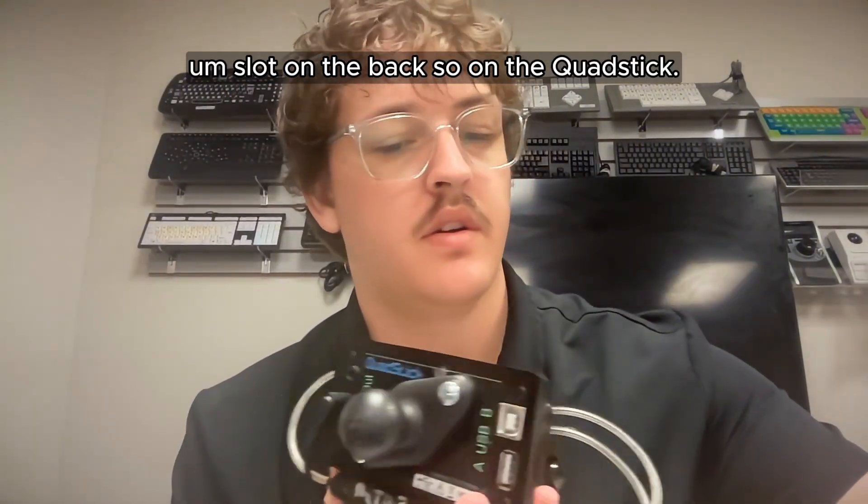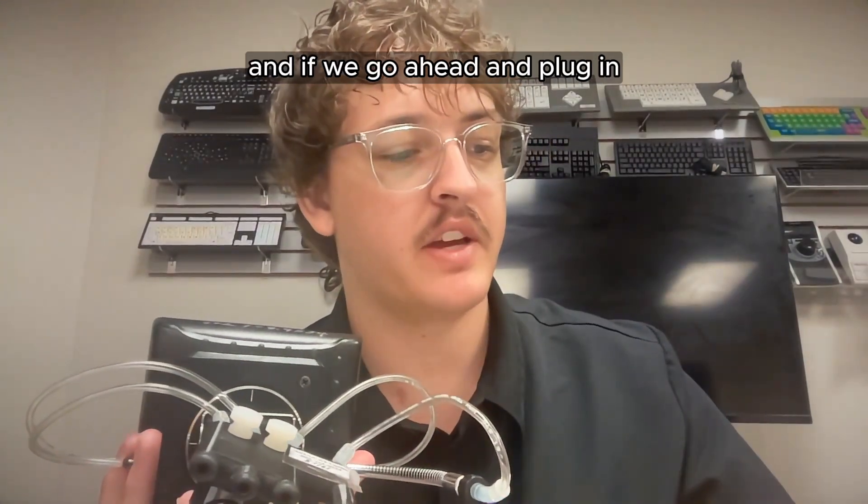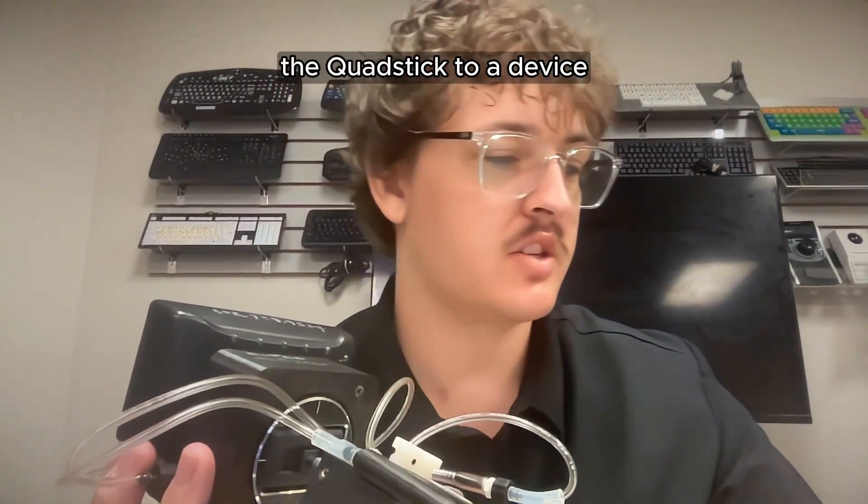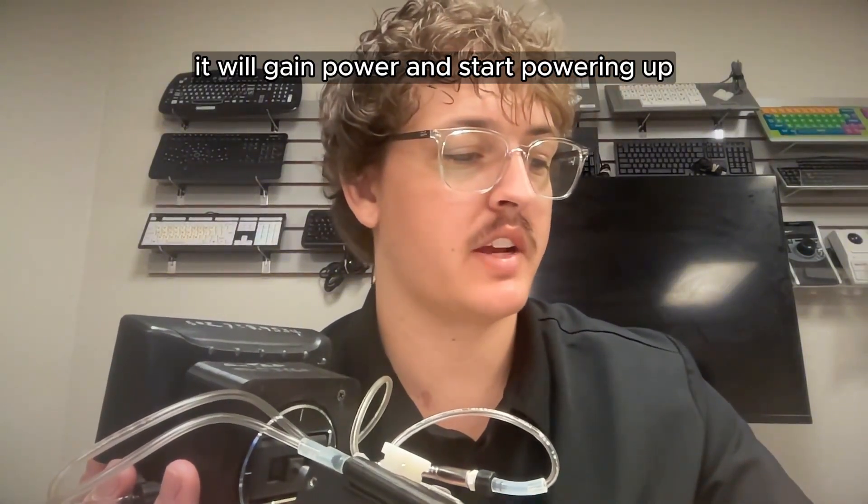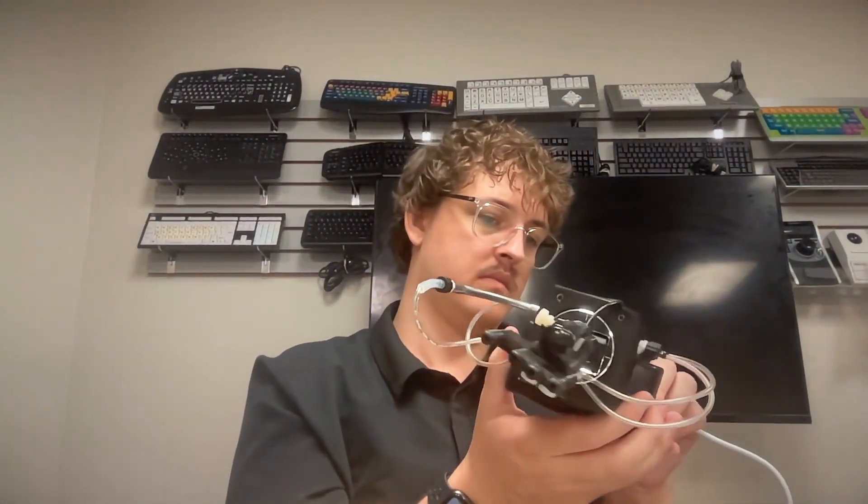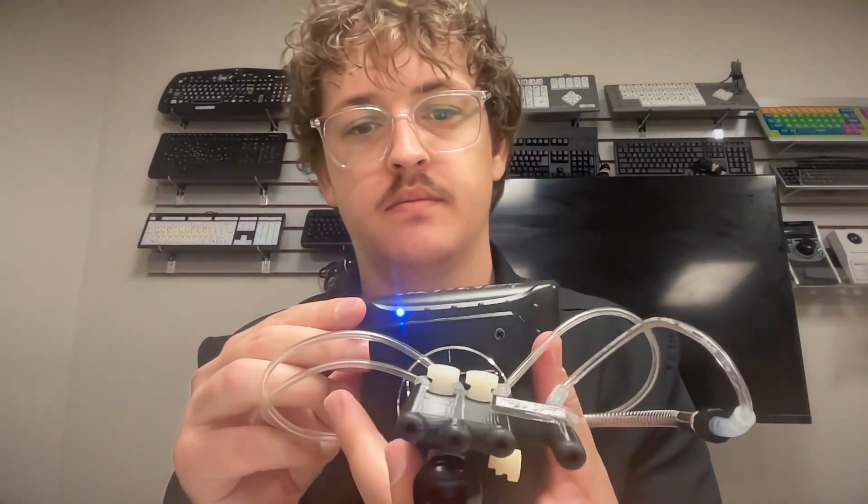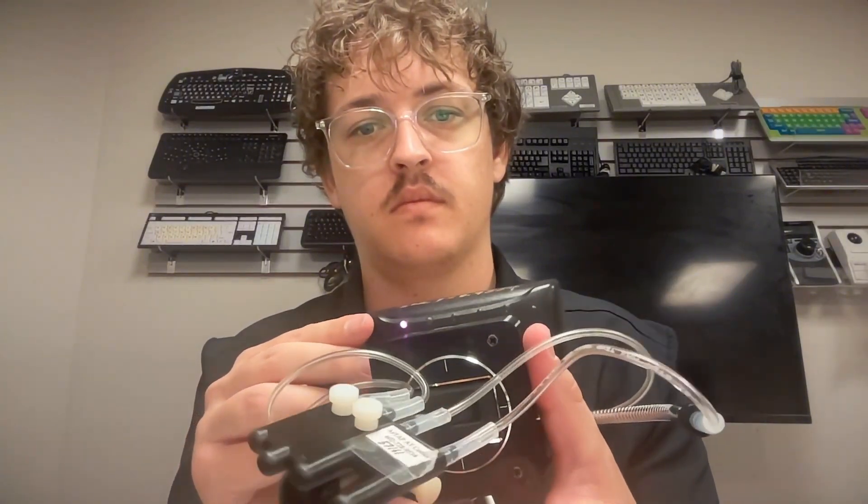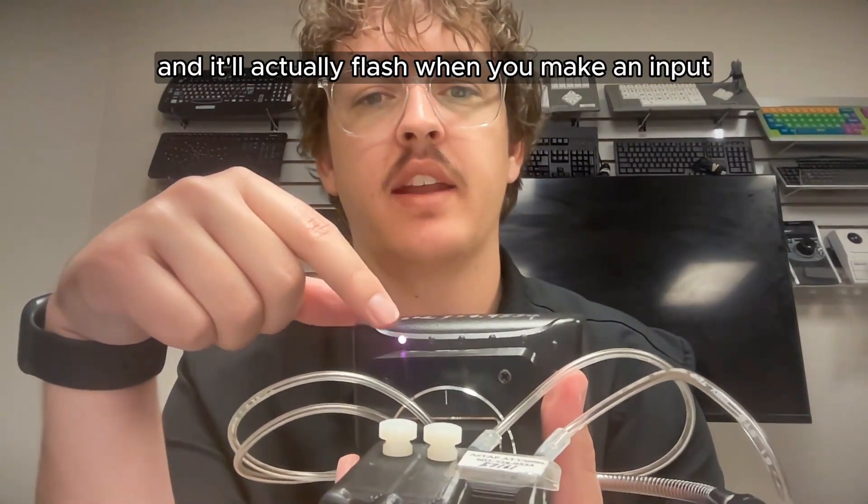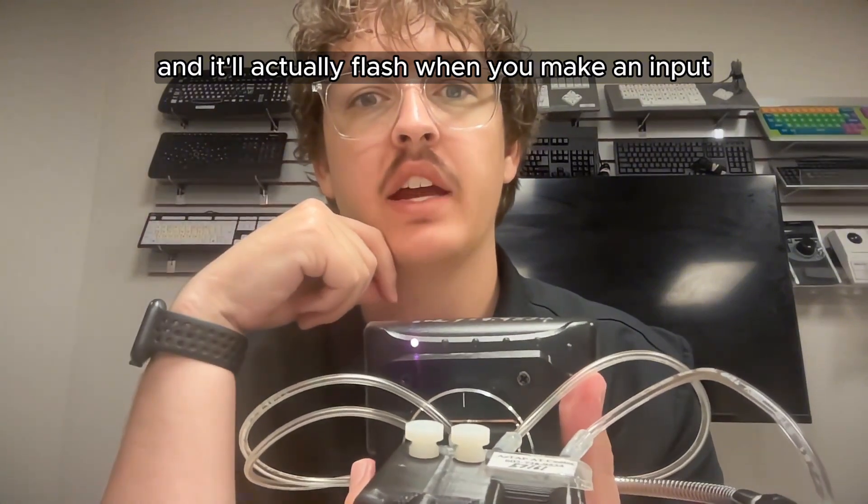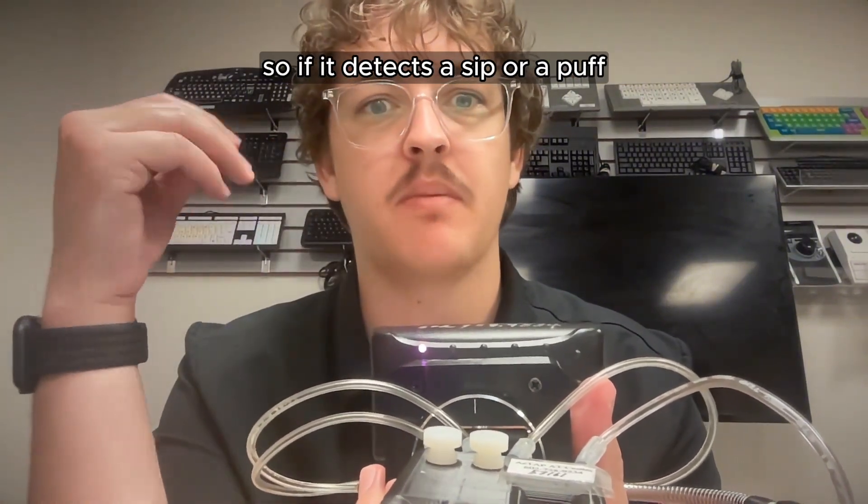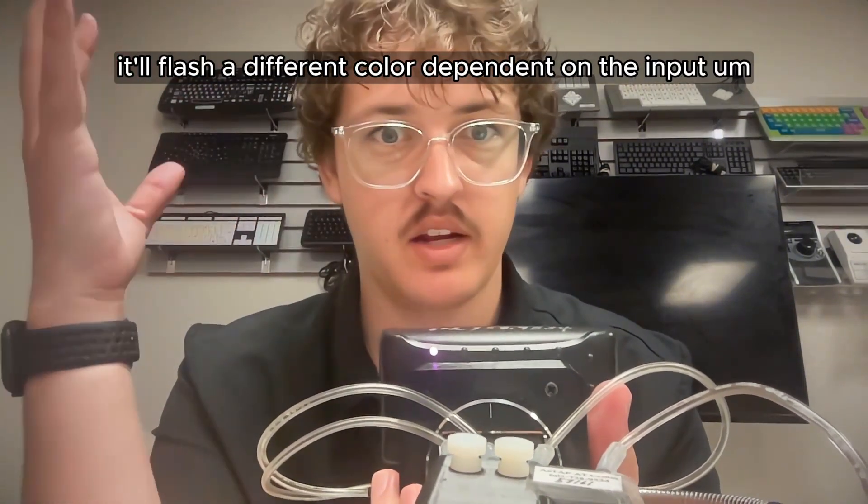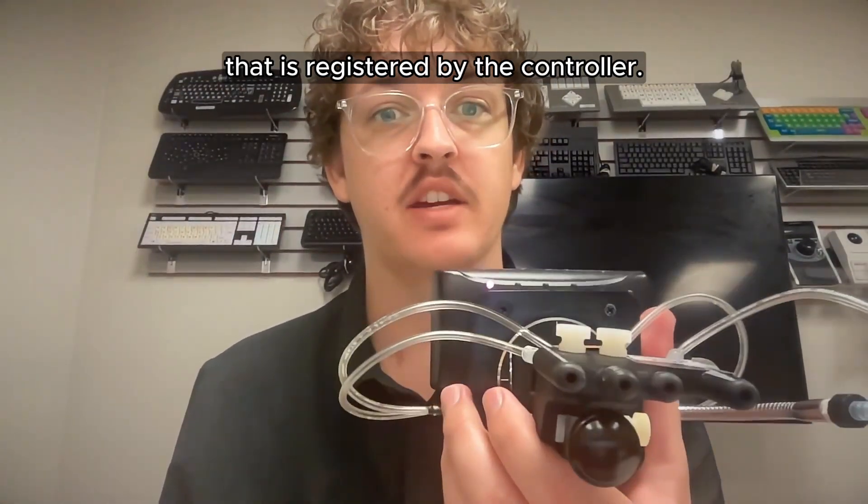So on the QuadStick, there's also lights up top. And if we go ahead and plug in the QuadStick to a device, it will gain power and start powering up. The QuadStick lights will light up, it'll let you know which profile you're on. And it'll actually flash when you make an input. So if it detects a sip or a puff, it'll flash a different color dependent on the input that is registered by the controller.